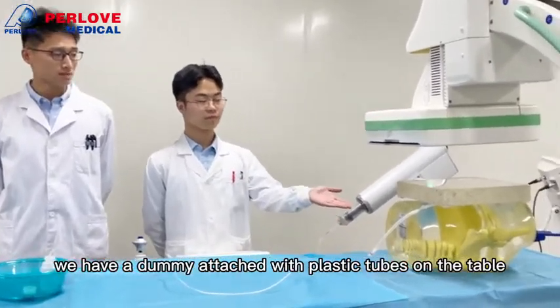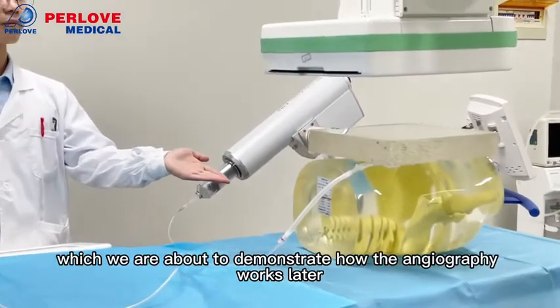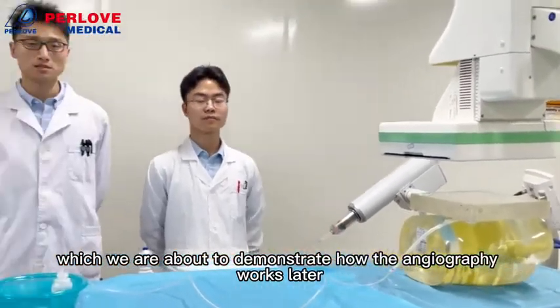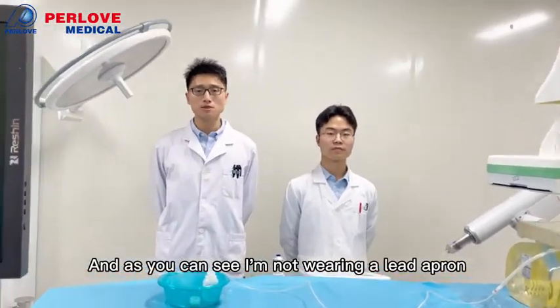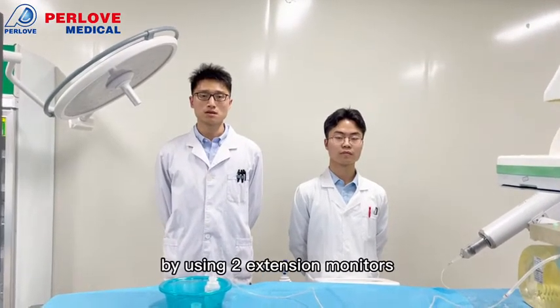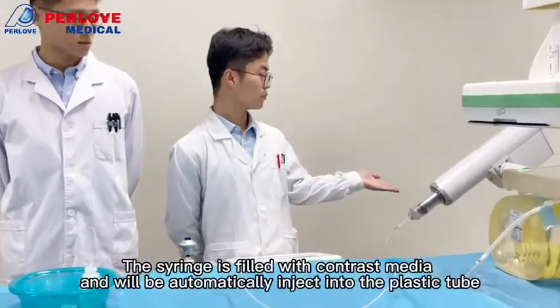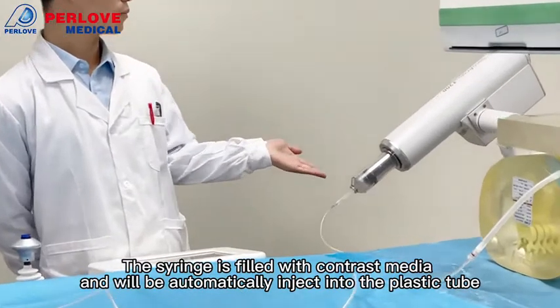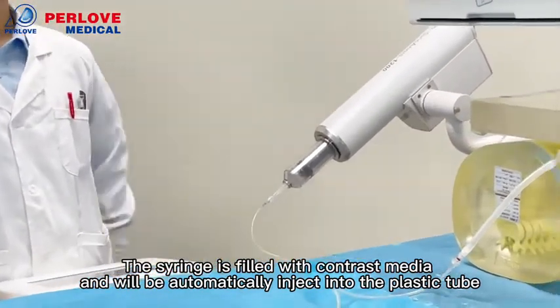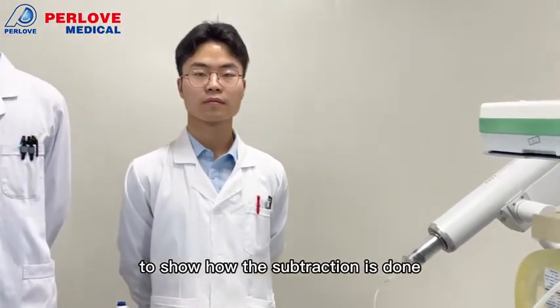As you can see, we have a dummy attached with plastic tubes on the table, which will be demonstrating how the angiography works later. We also have a DSA injector. The syringe is filled with contrast media and will automatically go into the plastic tube to show how the subtraction is done.